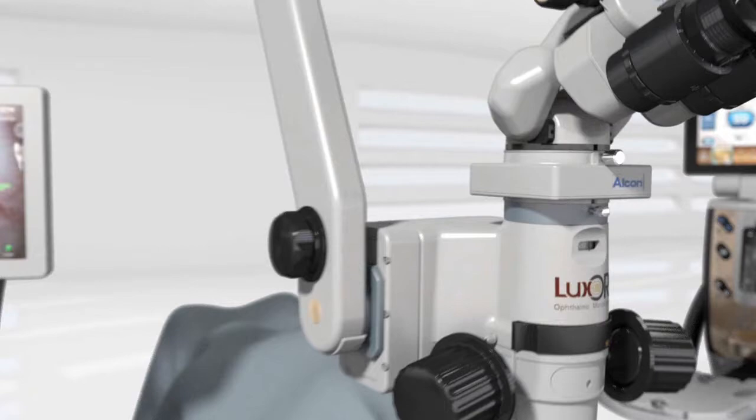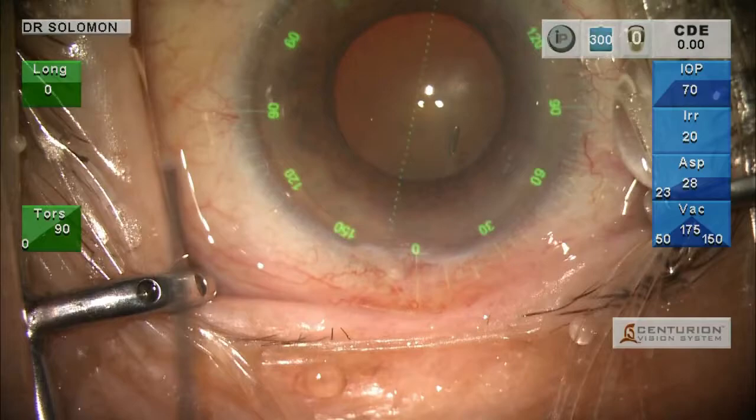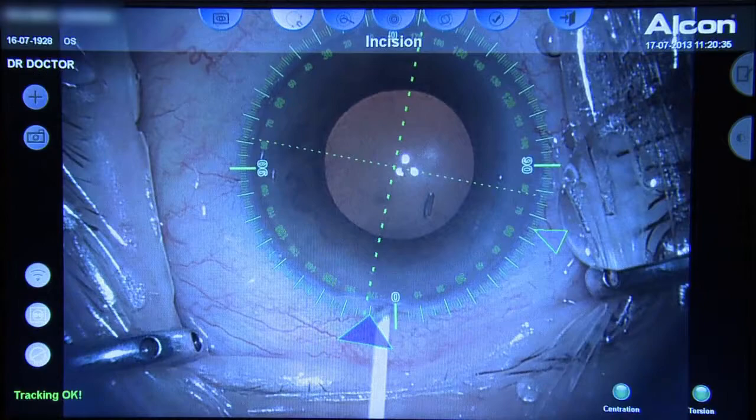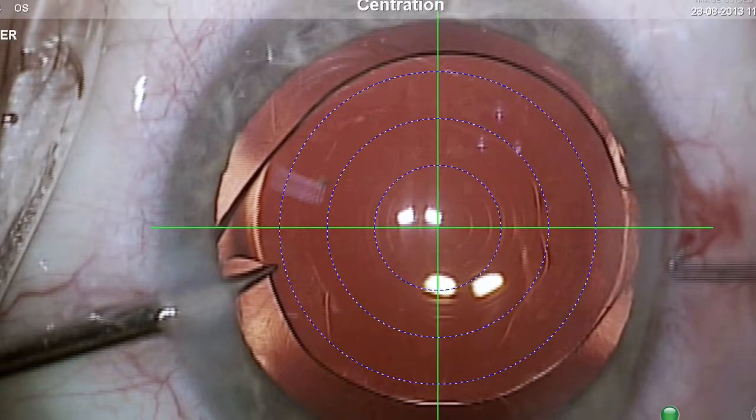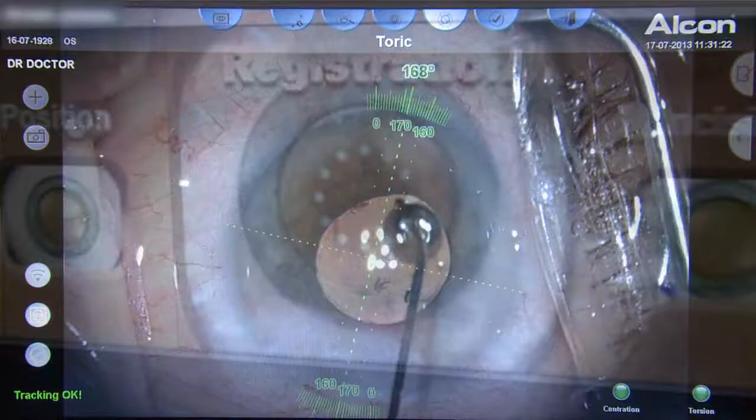Working in concert with a microscope integrated display, or MID, the Varyon Digital Marker also provides real-time tracking overlays through the optics of a surgical microscope. These computer-generated overlays offer a new measure of consistency and control for every surgical step of the procedure, including an incision guide, capsulorhexis guide, centration guide for multifocal IOL positioning, and toric alignment guide for lens positioning. All of these procedural steps can be wirelessly controlled by the Centurion Vision System foot pedal.